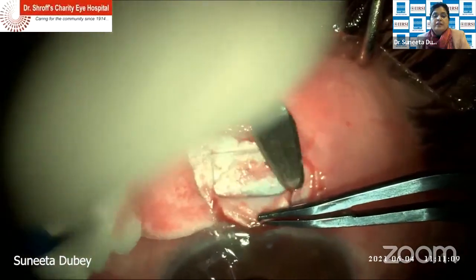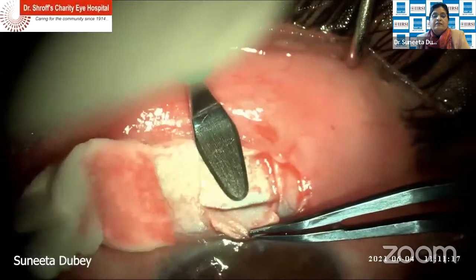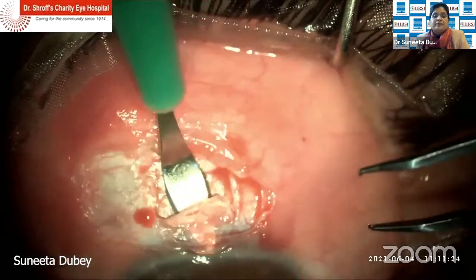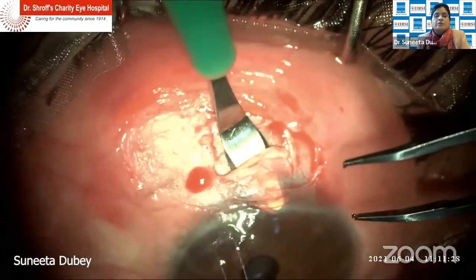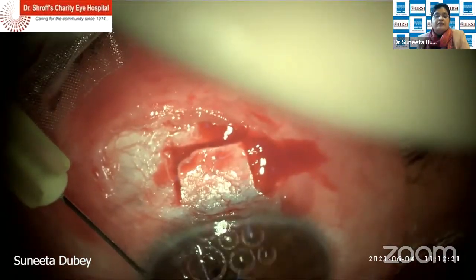More in the center, I think you have to dissect up to the clear cornea, because it is not a trabeculectomy. You are removing a part of the cornea also, a keratectomy also. This comes with the crescent. It doesn't come with the 15 number blade. Yeah, so that is why.